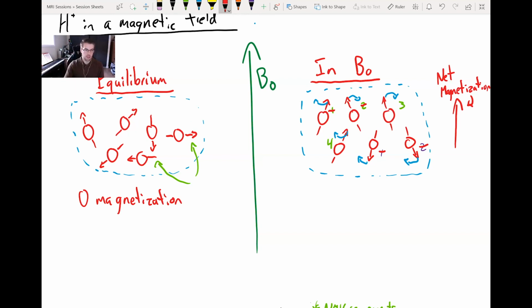And we also need to think about the lateral component. So if we have a general vector like this, I'll draw it because my arm is not that useful, it can be split into vertical components, which I'll make blue. The vertical component for this arrow that I've drawn would be like that.